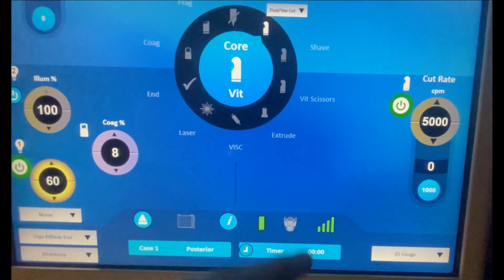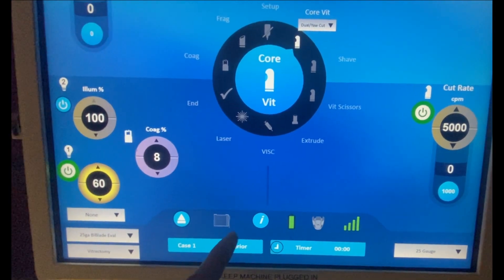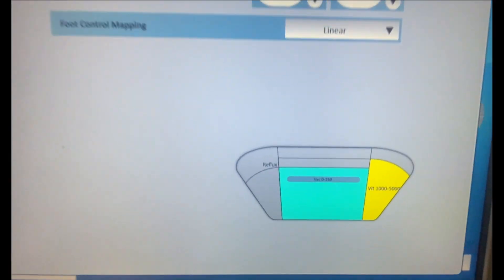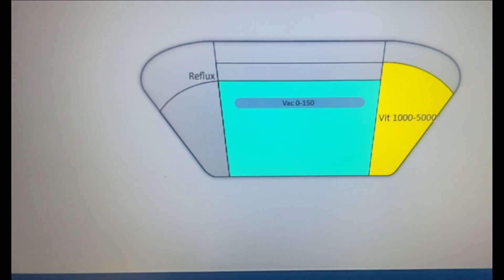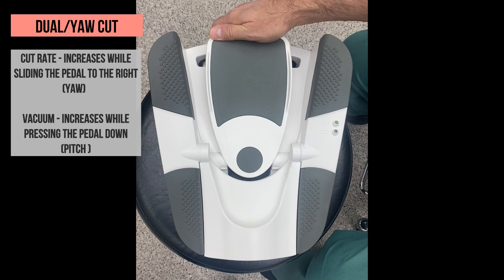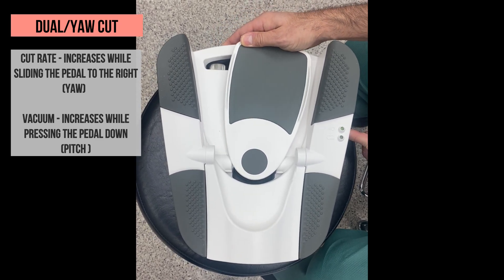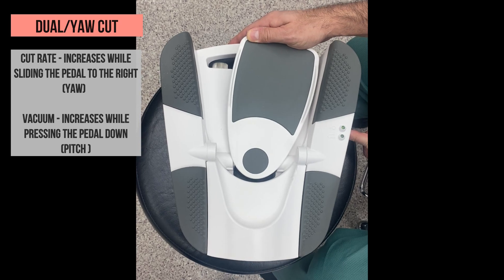Dual Yaw Cut sub-mode is the reverse version of the Dual Yaw Vacuum. In pitch here, there are various vacuum levels, and in Yaw, various cutting rates. While pressing the pedal down to the floor, the vacuum is gradually going up, and as we slide the pedal to the right, the cutting rate turns on and gradually increases.